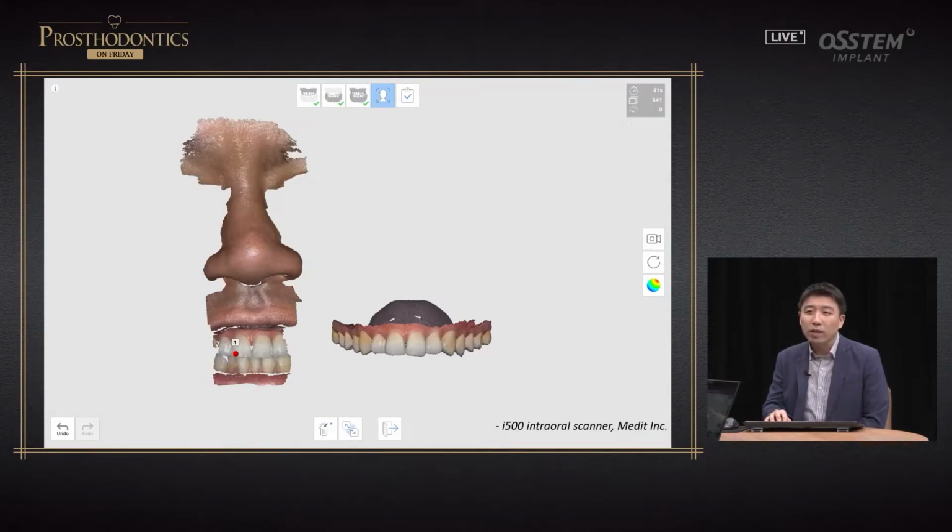At times, people use an oral scanner for facial scans. Oral scanners are excellent for scanning teeth. Teeth scanning is done excellently, and facial scans can be done very nicely. You need to take a facial scan with a scanner with a very limited scope, so it may take a lot of time. The downside is that the patient needs to maintain his or her expression with teeth exposed for an extended period of time. You can center on the eyebrow and nose and check the midline, and the profile and contour of the face can also be checked using this tool.